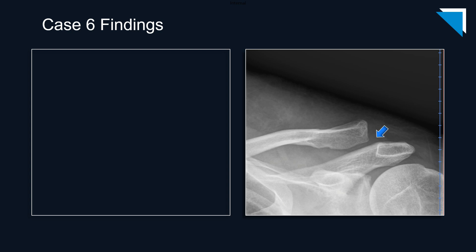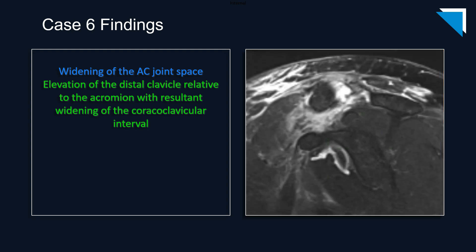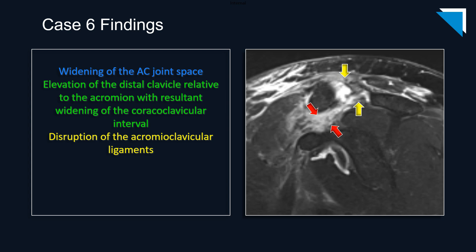There is mild widening of the acromioclavicular articulation, with elevation of the distal clavicle relative to the acromion and resultant widening of the coracoclavicular interval. The sagittal fluid-sensitive images from the MRI are excellent for evaluating the supporting ligaments of the shoulder. Here we can see the widening of the acromioclavicular joint space is due to underlying rupture of the acromioclavicular ligaments. Similarly, the widening of the coracoclavicular interval is due to rupture of the underlying coracoclavicular ligament.